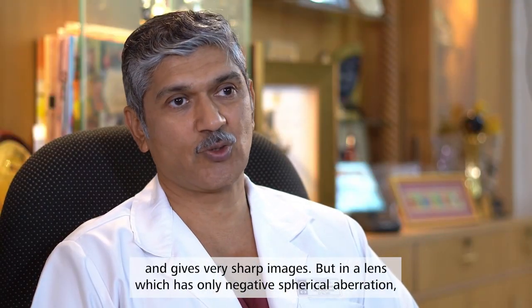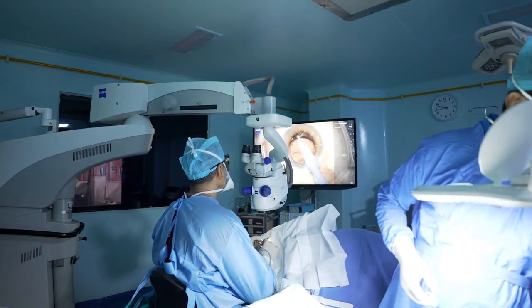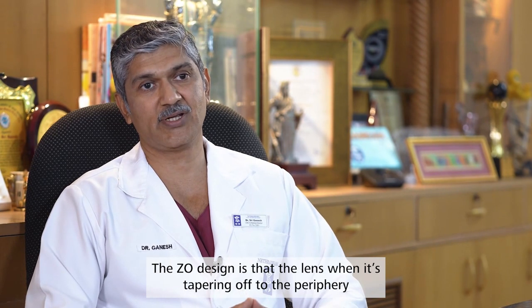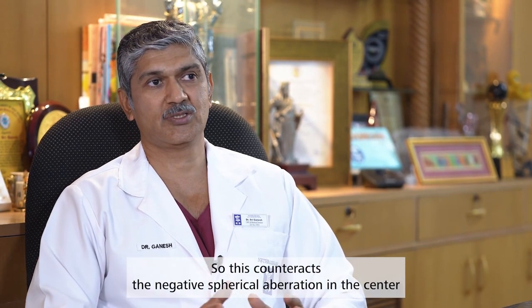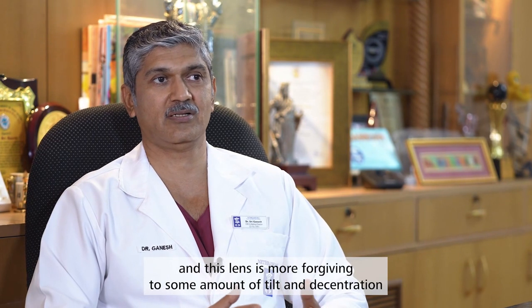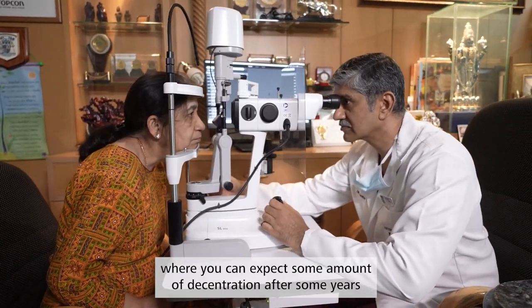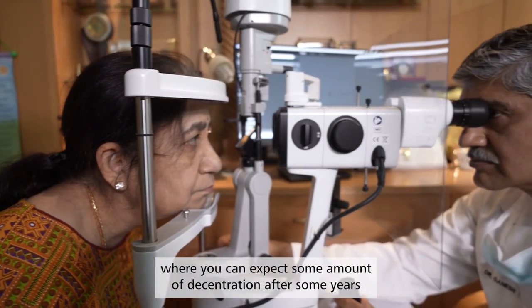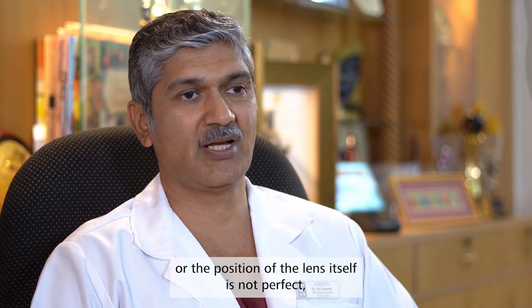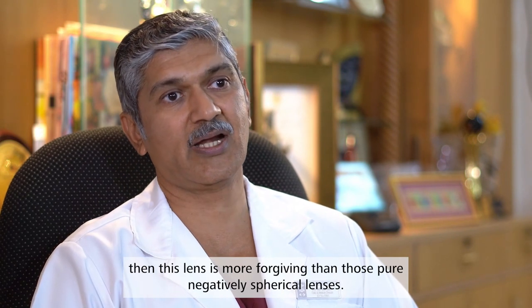But in a lens which has only negative spherical aberration, it is more sensitive to tilt and decentration. The Z-O's design is that the lens, when tapering off to the periphery, has some amount of positive spherical aberration. This counteracts the negative spherical aberration in the center, and this lens is more forgiving to some amount of tilt and decentration — especially in cases like pseudo-exfoliation where you can expect some decentration after some years, or when implanting the lens if there is zonular laxity or the position of the lens itself is not perfect. This lens is more forgiving than those pure negative aspheric lenses.